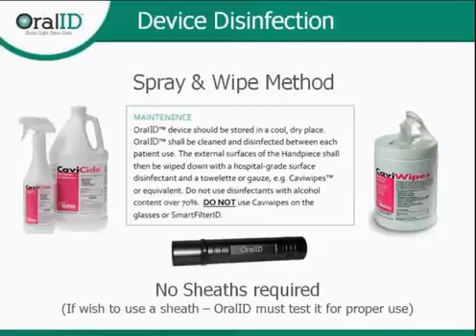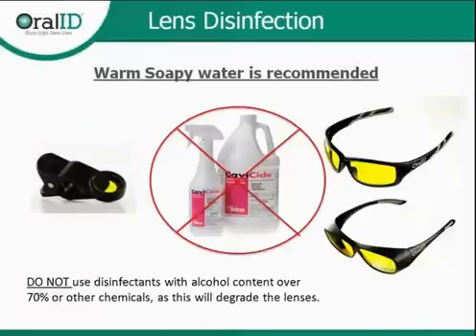To disinfect your unit, you just spray and wipe the entire thing. Any hospital-grade surface disinfectant is suggested or recommended. But when you're cleaning the glasses and the smart filter, if you use those chemicals over an extended period of time because of the high alcohol content, it will cause them to deteriorate and they'll kind of start to fall apart after about a year of use.